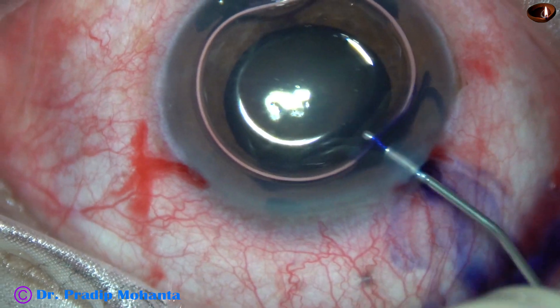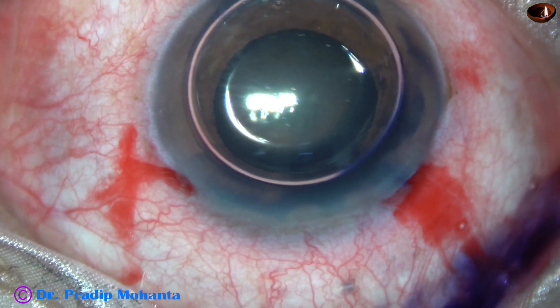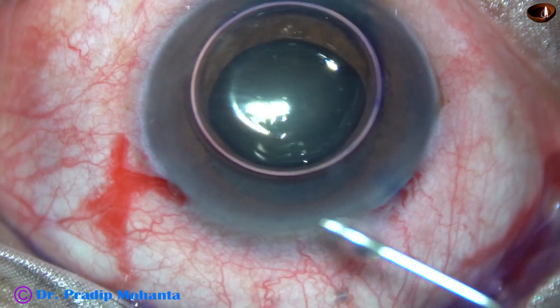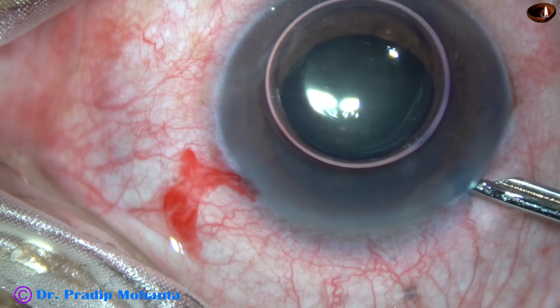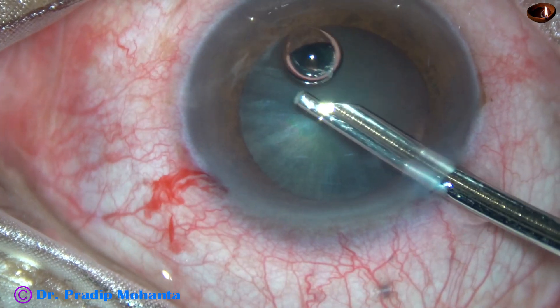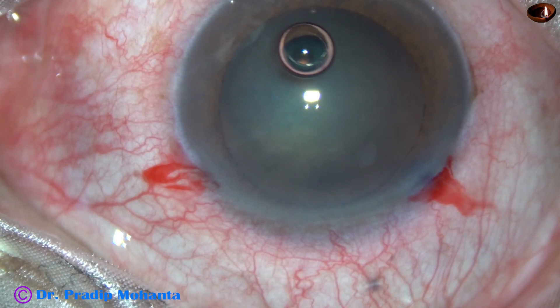At this time, the size of the pupil is a little on the smaller side, about 5 mm. So I am going to use a bit of adrenaline. Here goes the adrenaline. With adrenaline, the pupil starts dilating, and we see that the pupil has dilated quite well. The size of the pupil is now about 8 mm, or even 9 mm.